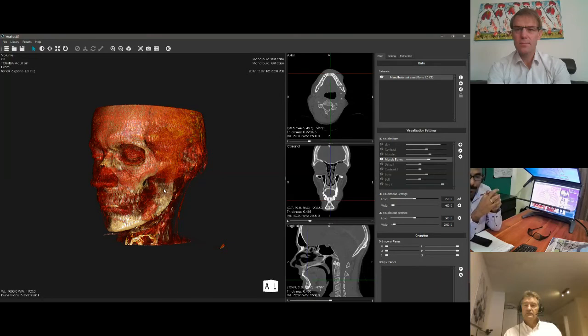One of the things we have to do is be able to show extractions from bone, but also from skin, and also from the muscles around, because those are operations where part of the bone, including skin and muscle and nerves, are being moved from one part of the body to another.